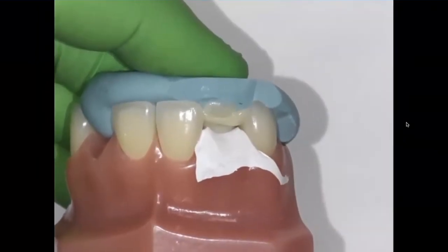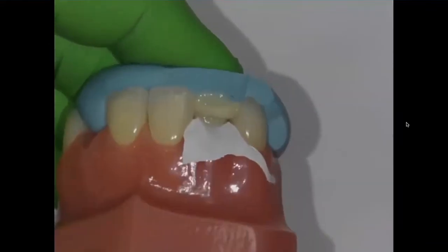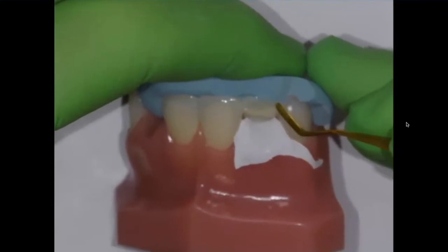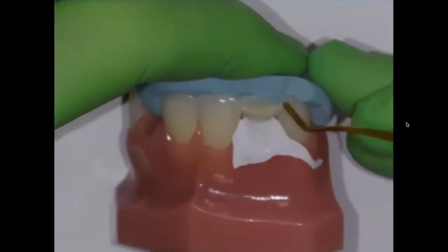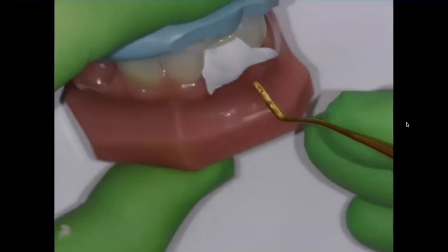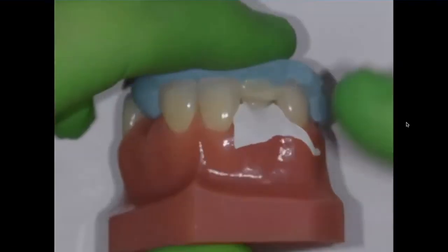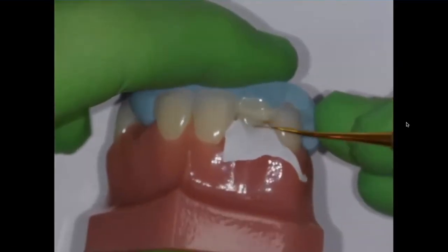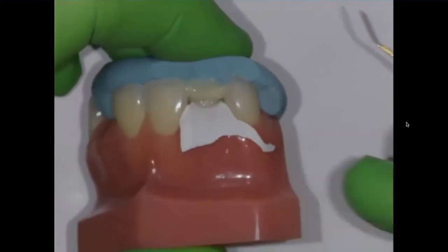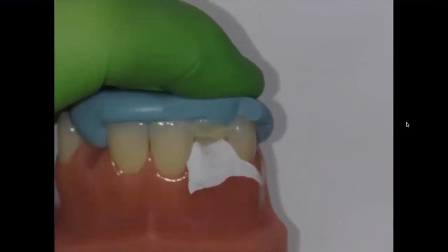I'm going to dim my light a little bit — it's starting to set my composite. So let me dim the light while I'm working. You can see as it's coming over top of the ribbon bond into the canine, just making sure that blends in. Looking down from the incisal, I can see that the composite has blended in nicely onto the ribbon bond. In the mouth, I would use a mirror to make sure the same is happening on the lingual. That's going to give me my shape and my contour, so the lingual wall will be finished.